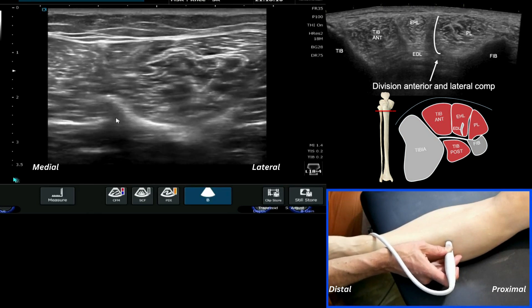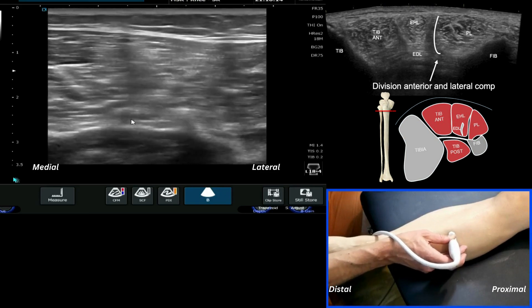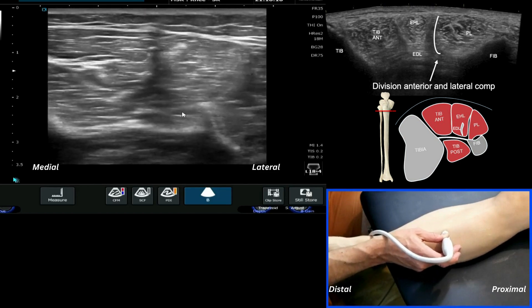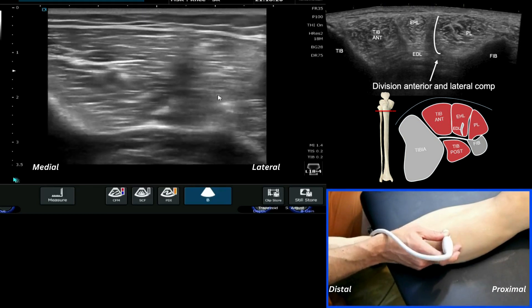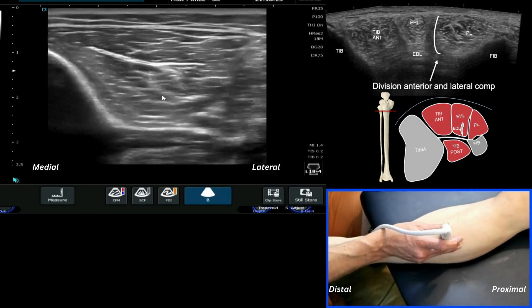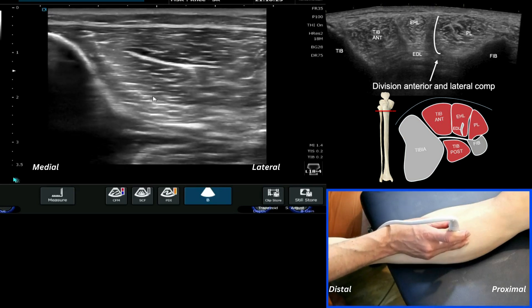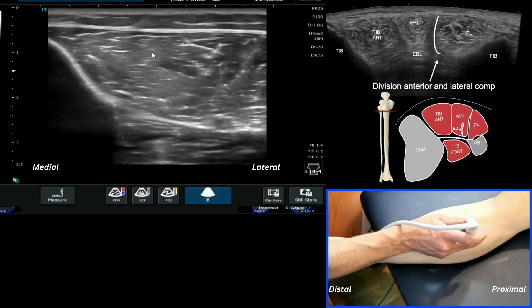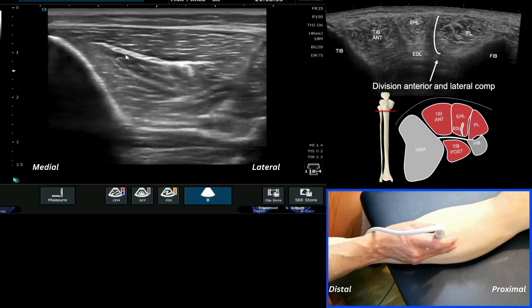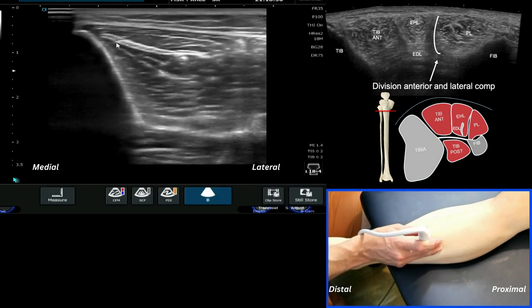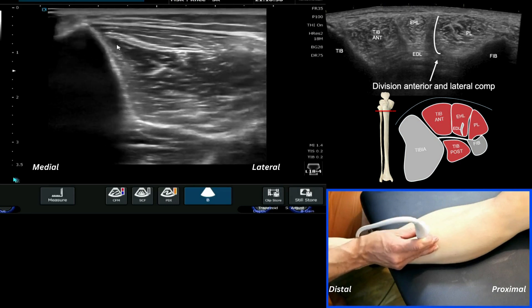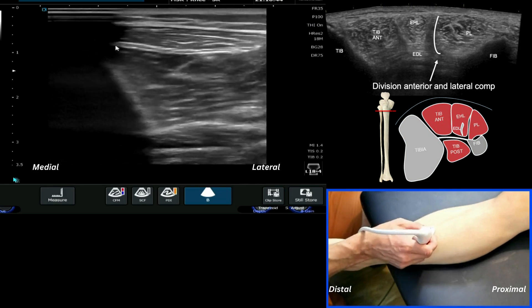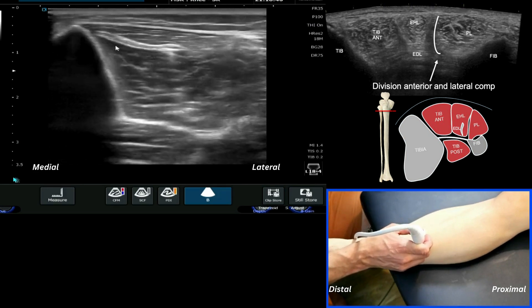We can still see the skeletal landmark of the fibula, which forms a nice border laterally. Our anterior compartment sits between that lateral spike of the fibula — where you've got EHL and extensor digitorum — and more medially, before the tibia, the large muscle of tibialis anterior. As it runs down, you can see it forms a very large tendon slip within the muscle itself. You could always explore that in long axis as well.